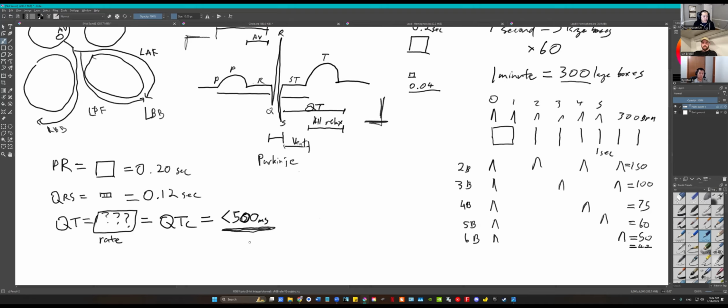If it's over 600 and this is a new diagnosis, they get admitted because they need to get this taken care of, or they need a pacemaker, or sorry, an implantable defibrillator. But usually these are metabolic derangements, so they get admitted for this to be corrected, like I give them more so magnesium or what have you. I was going to say, is that why we give magnesium if they have prolonged QTs, to help it relax more? Yeah, that makes sense.